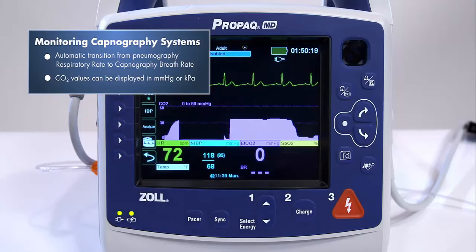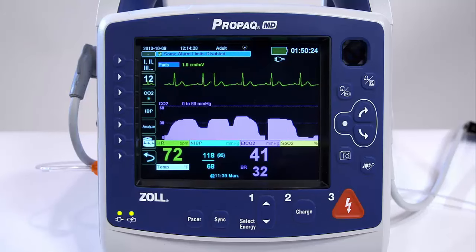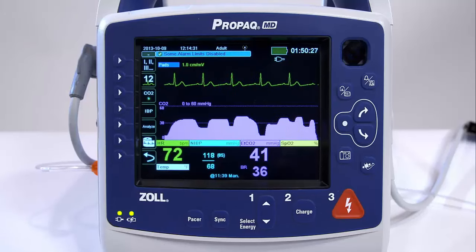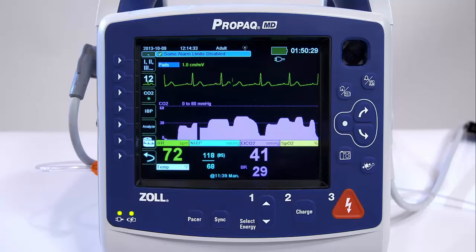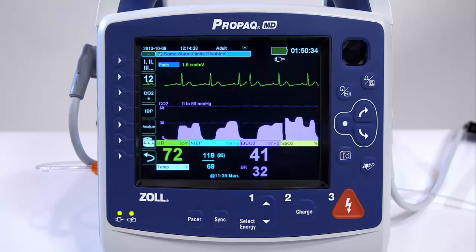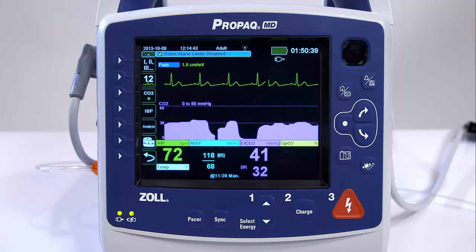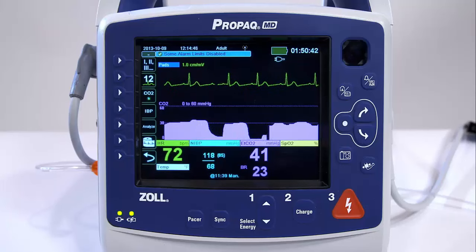CO2 values can be displayed in millimeters of mercury or kilopascals. The CO2 display gives the current ETCO2 value — the concentration of carbon dioxide detected at the end of each exhalation — and after a delay of approximately one minute, the patient's respiration rate in breaths per minute, identified as BR.